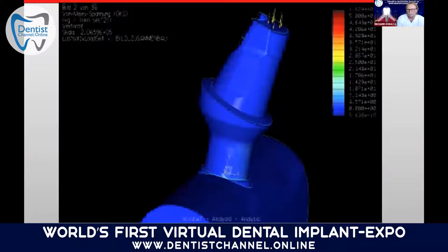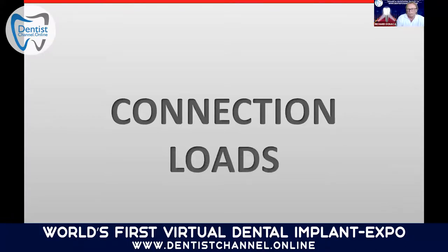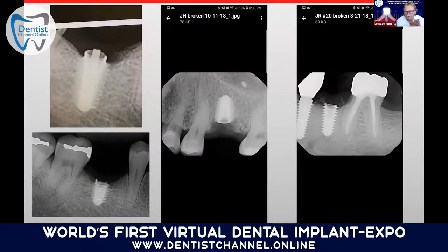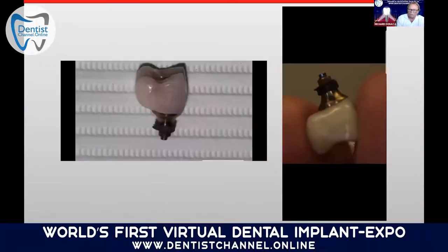So the longer the connection is, the more able it is to uphold the bone and tissue levels and, of course, reduce breakages. In general, when you have shorter connections rather than a long connection, the problem is screw or implant breakages. So if a company is promoting a conical connection, then it should be a long conical connection and not a short conical connection, which causes loads on the implant shoulder, the screw, or the abutment to implant connection.